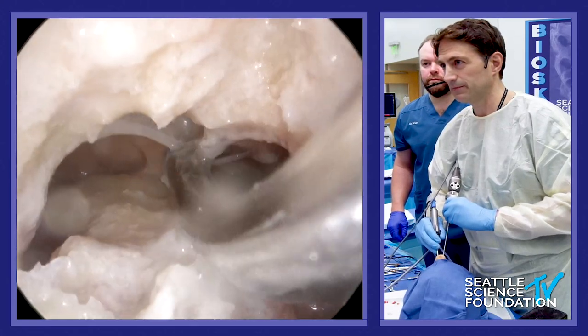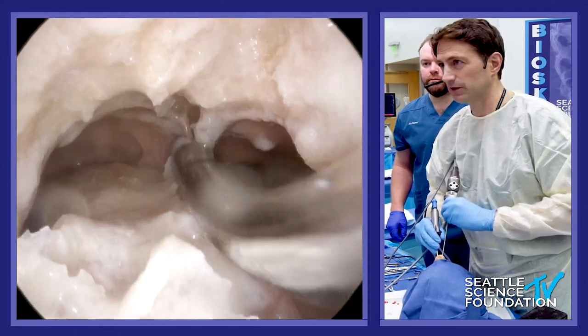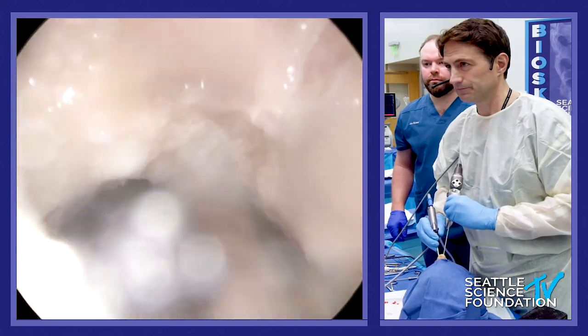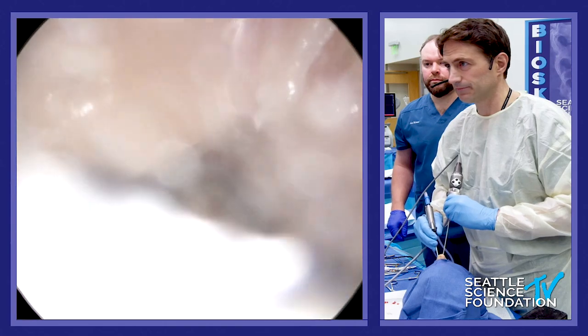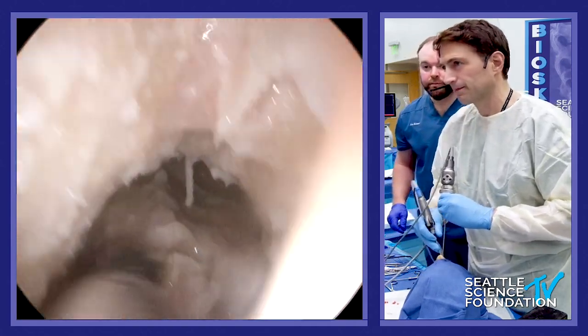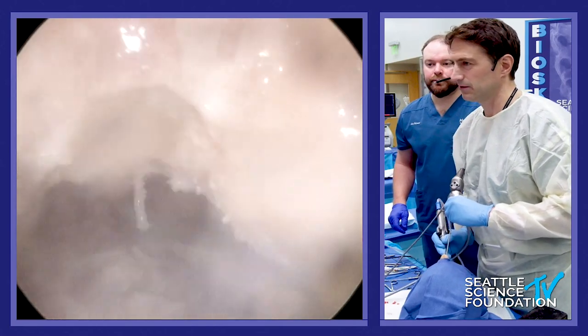I want one cavity. If there are septations within the frontal, take them down — you want to take them all down. One cavity for steroid rinses. Same thing on this side.